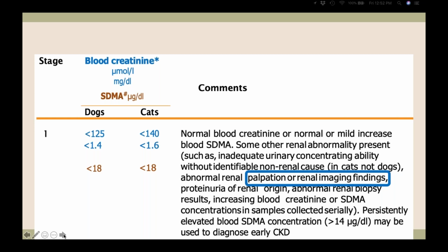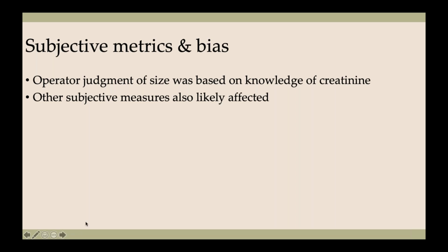So I agree, it's not normal. We should know that it's not normal. And I think the problem with what to do is the follow-up, which is kind of the big question that I hear from a lot of vets wondering what to do with that information. Well, that might be interesting for another journal club, because there are a couple articles out now that look at early or at-risk cats. And I guess to me, the value of knowing they're stage 1 is that you know they're at risk, so you're careful with them.